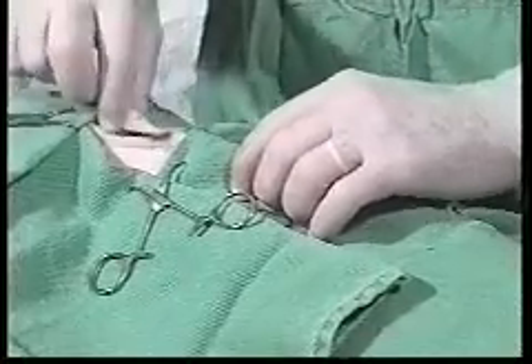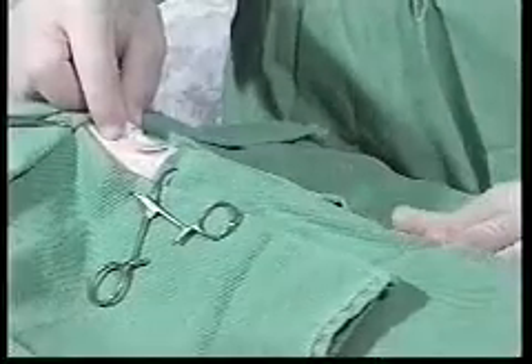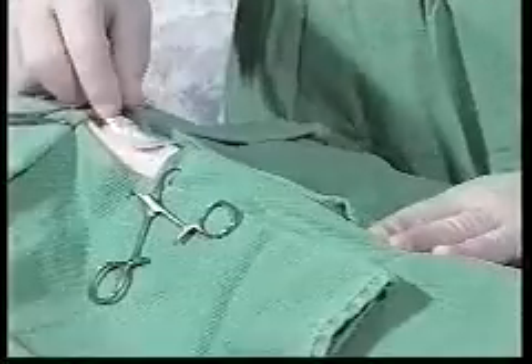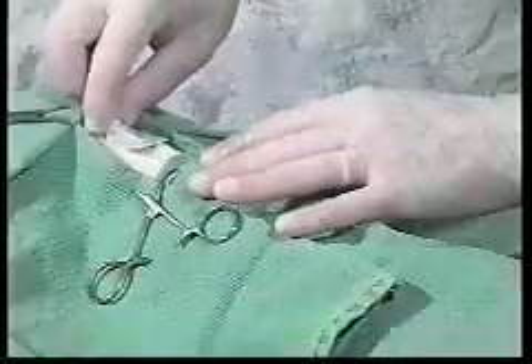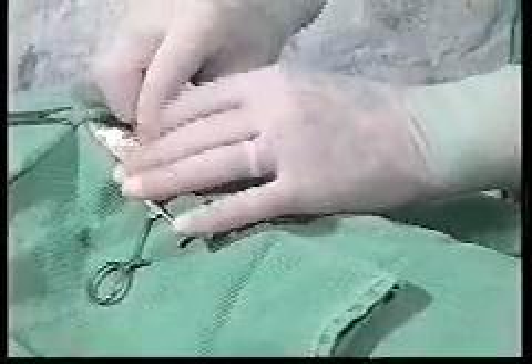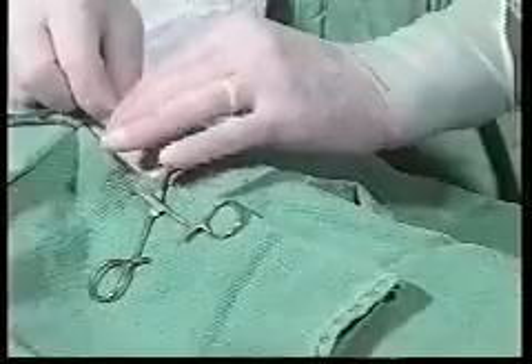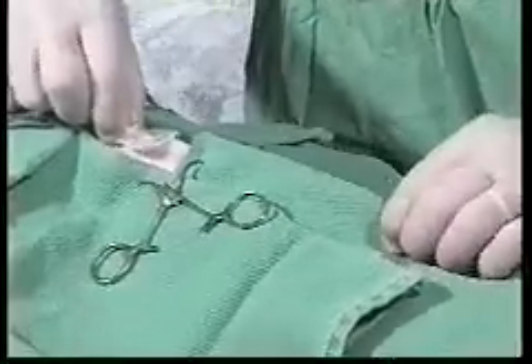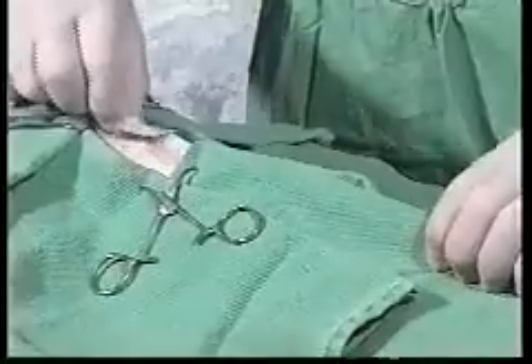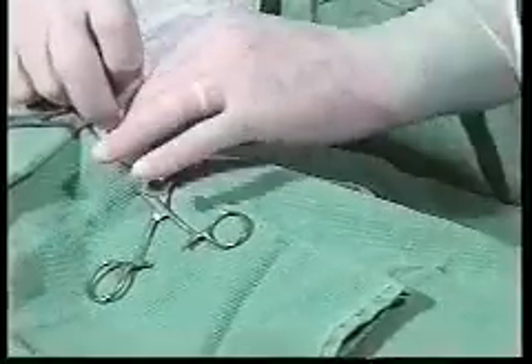We want to place this tube just off the midline — we don't want to place it right down the midline. If we have to change the tube due to an infection or a blockage, by having the tube on one side or the other, we always have the other side to go back to. Once we feed that tube all the way down so that the skirt covers the incision, we are going to disconnect the stylet, hold the end of the tube so that we don't pull it back out, and work that stylet loose.